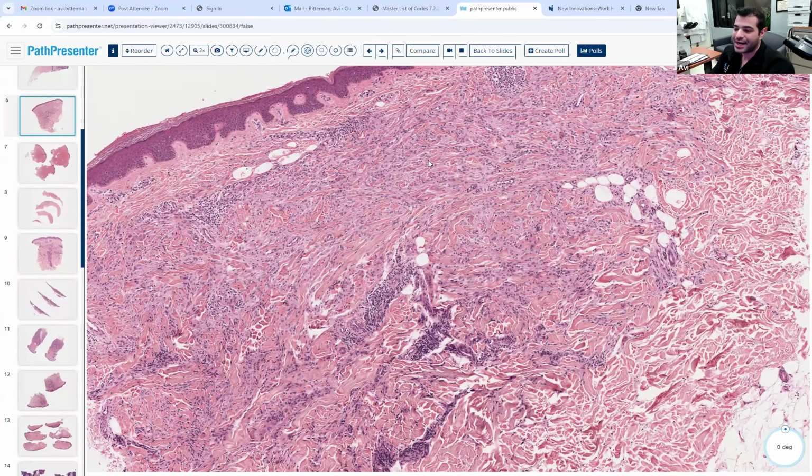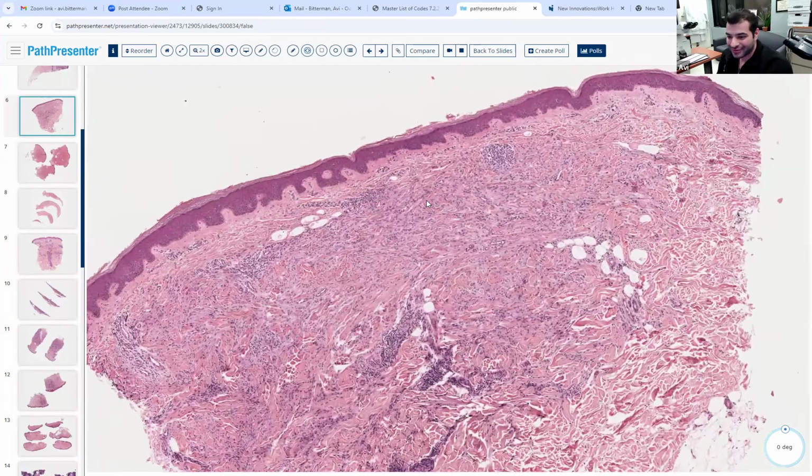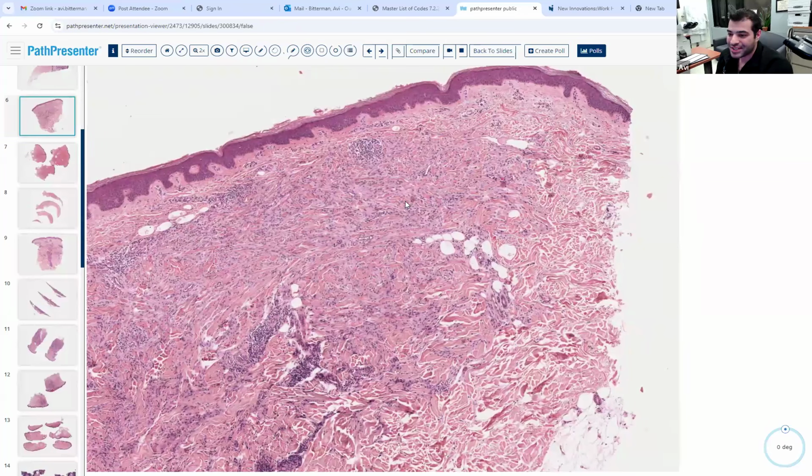The way I would describe this is a granulomatous dermatitis, which just means there are histiocytes or giant cells. In a granuloma, my understanding is that it is more of a discrete type of nodule. In that sense, they would be walling something off, but I don't necessarily think it has to have this palisaded appearance that you see histologically.